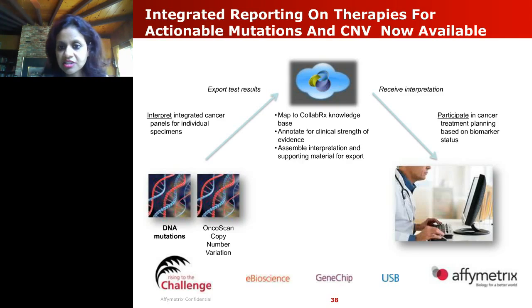I can start with the question that came in through the Q&A. It says, I thought that the OncoScan FFPE kit calculates the CNV in the tumor portion. Does this mean that the algorithm can tell us what the % tumor content of the sample is, as in normal versus tumor cells of the FFPE specimen?